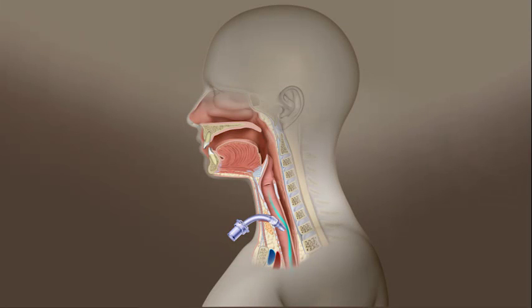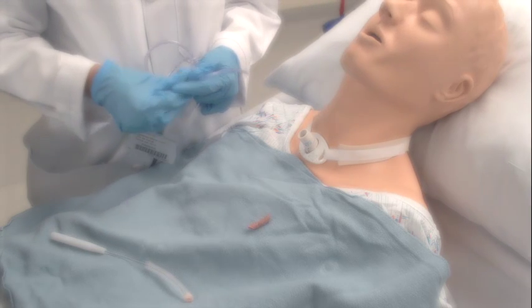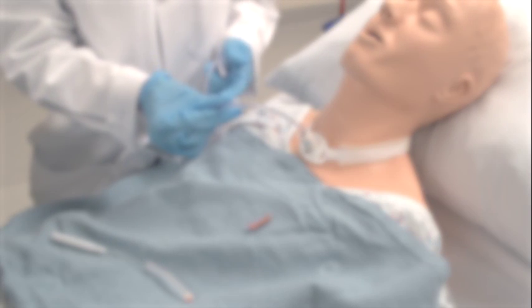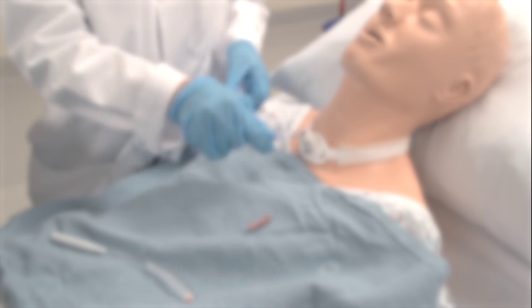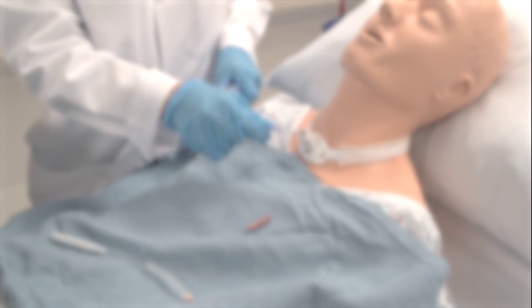Although we cannot completely eliminate the risk for accidental decannulation, if we are aware of the risk factors and take necessary precautionary steps, we can reduce accidental decannulations. And if they do happen, we will be prepared to respond appropriately to this emergency. First, monitor the tracheotomy tube during your rounding. Note if your emergency trach kit or spare tracheotomy tube is at the bedside.